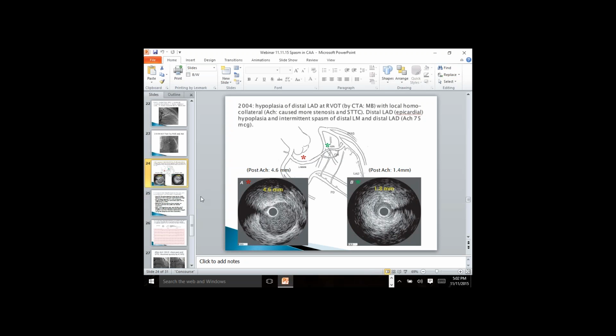stage with thrombolytics in one, with thrombectomy in the other, they showed systolic compression like myocardial bridge at the level of the total occlusion. So in those cases, we published those cases, the myocardial bridge was at the level of the clot. So that is the kind of stenosis, fixed stenosis that you can see at myocardial bridge. Atherosclerosis is extremely rare.